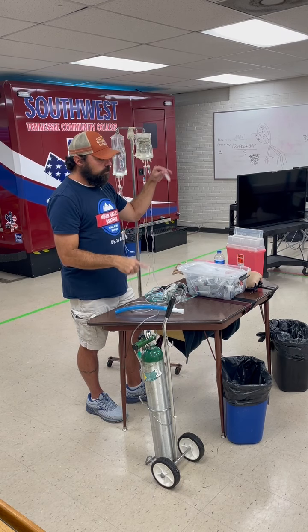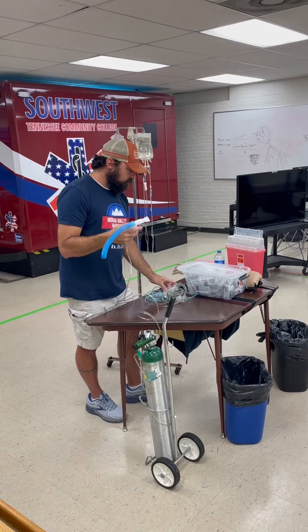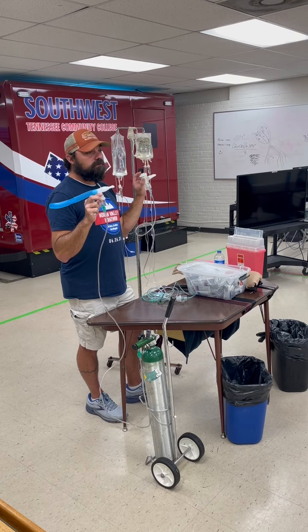How much of this do you put into one of these things? The whole thing. Now, we have several up here. Thank you, Mr. Danny, by the way. We have several different versions, and there are even more than this. Nebulizers come in many shapes and forms, okay?